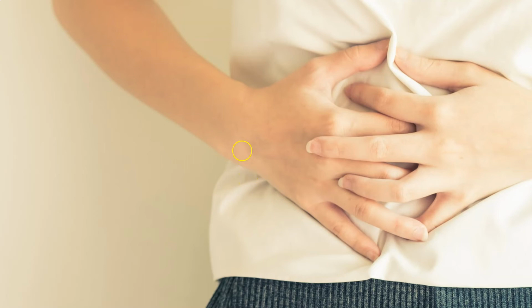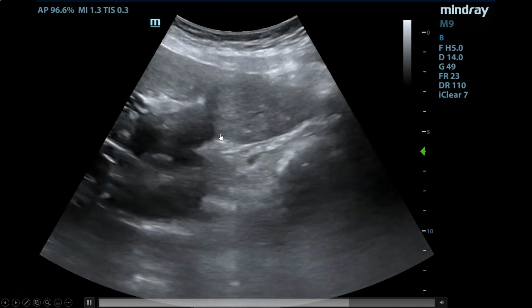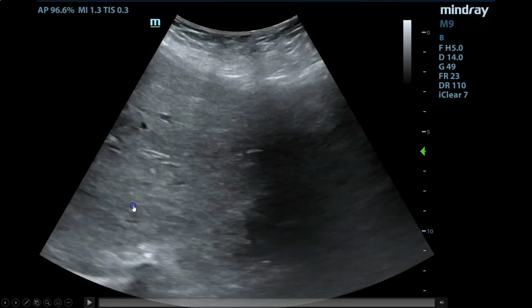So moving on. Our third patient presents with severe abdominal pain. Seems to be an epidemic. And now, you're looking through, and you're trying to decide if there's anything abnormal on this ultrasound. So we'll start by going back to your long axis view.